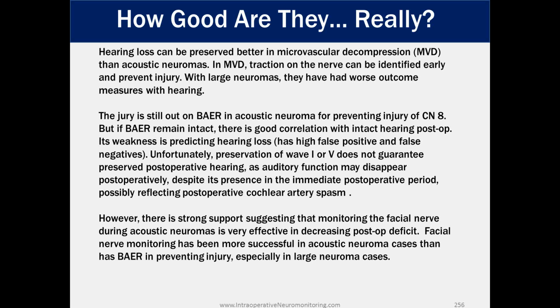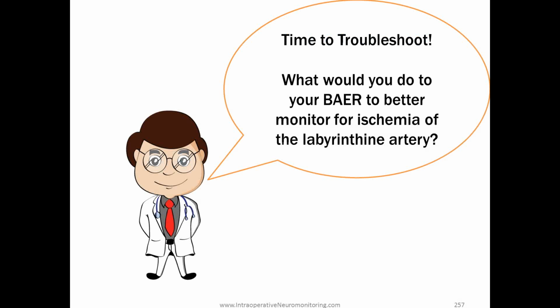However, there is strong support suggesting that monitoring the facial nerve during acoustic neuromas is very effective in decreasing postoperative deficit. Facial nerve monitoring has been more successful in acoustic neuroma cases than BAERs in preventing injury, especially in large neuromas. Okay, so now ABR, it's time to troubleshoot.